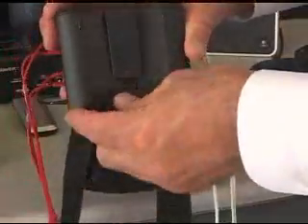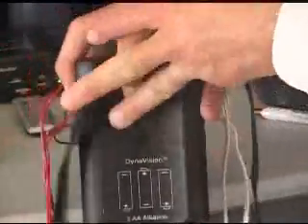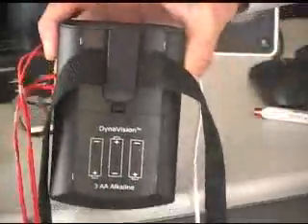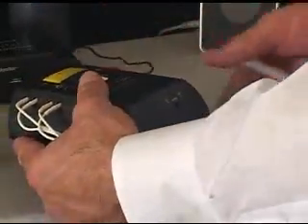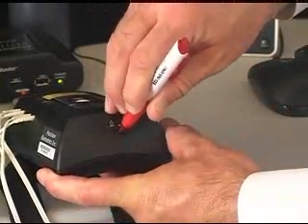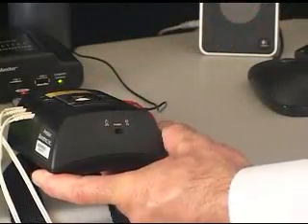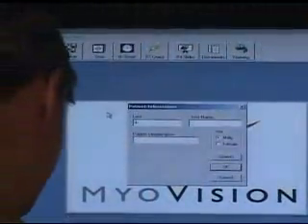The belt, you can actually use two belts together if you need to put it on someone larger. It goes behind on the dynamic EMG device, the DynaVision, and you turn the device on with the travel switch. Normally you just leave this on and make sure you leave the device in a position where the button's not being pressed. Turn it off only if you need to reset the device or if you're traveling with it. The white button turns it on.